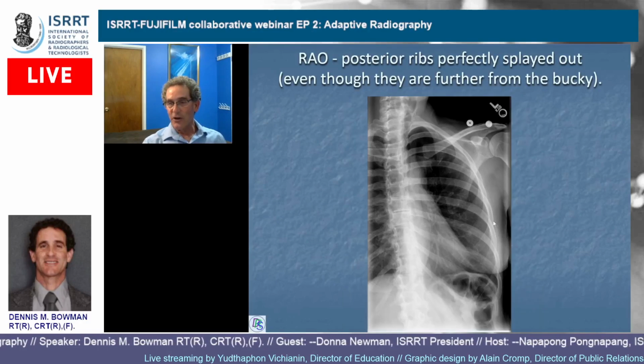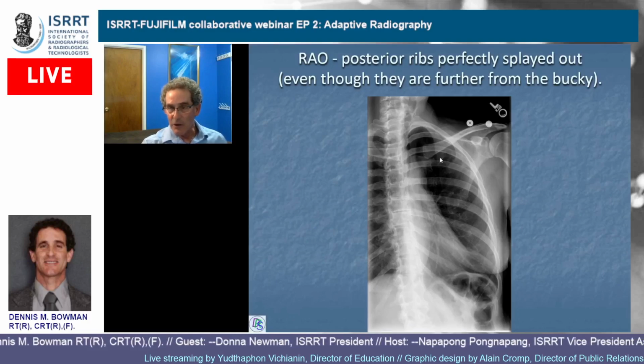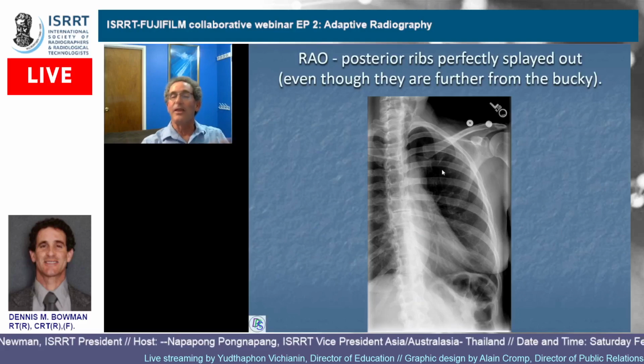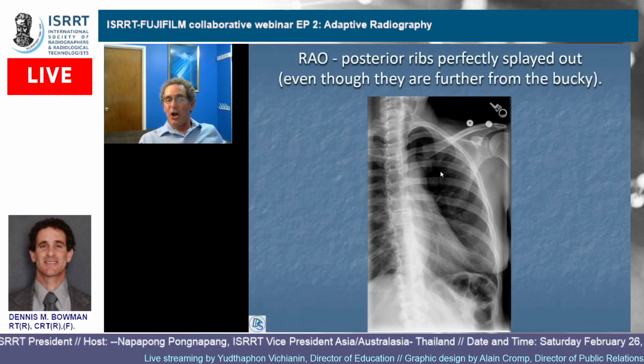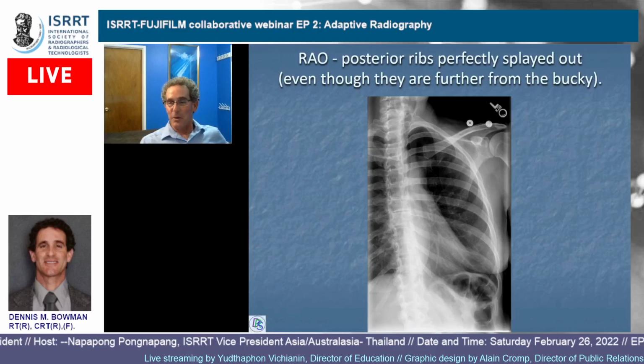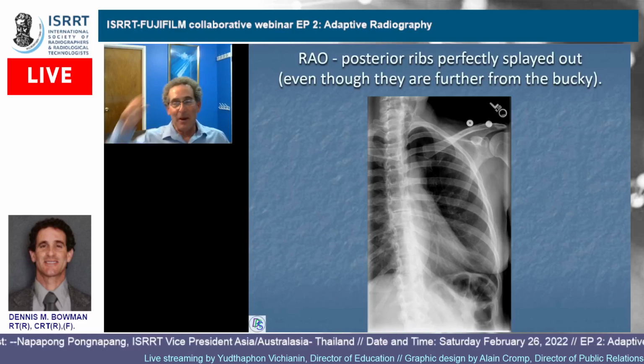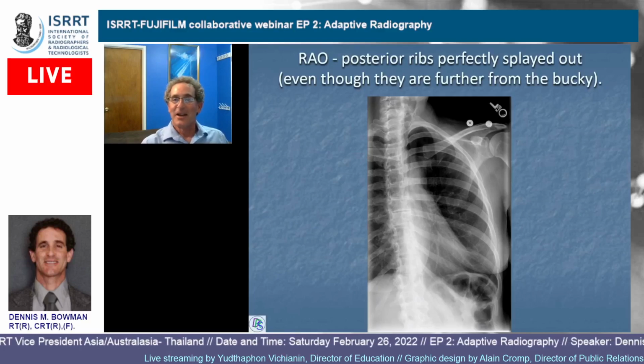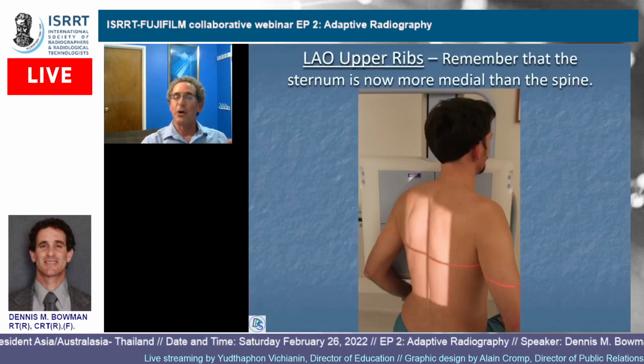So here's a lot of posterior. And then, posteriors are fantastic, but you go anterior, kind of. I don't even see it barely. I guess that's it. And then most places would then do a lower AP rib shot, and that would be it. And you go, man, when did you ever really see a good anterior rib? And the answer is you didn't, unless you do both obliques.